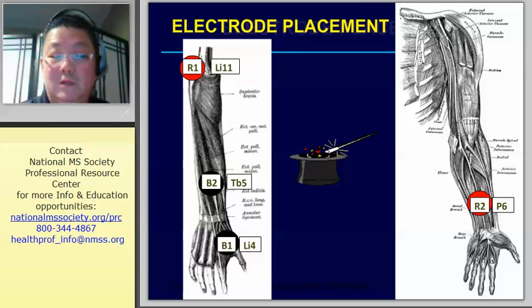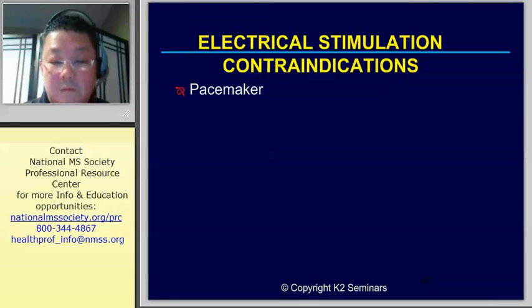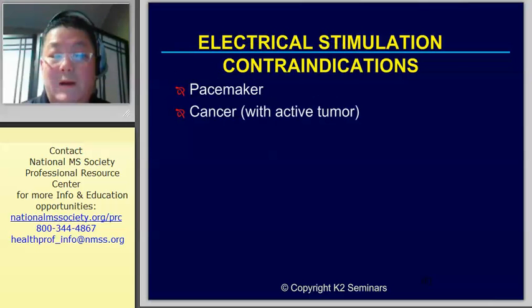The second channel is B2, which is just barely touching, in this case, the ulnar bone, the head of the ulna. And directly opposite that is R2, or the red electrode. Between these 4 electrodes, you can kill off any pain anywhere in the body using that sensory or motor analgesia ideology. So the parameters are already talked about. Now we're talking about where the electrodes go. Yes, pain anywhere in the body. If you don't believe it, try it out. Most of my patients are pain-free in my clinic within 10 or 15 minutes at the most.